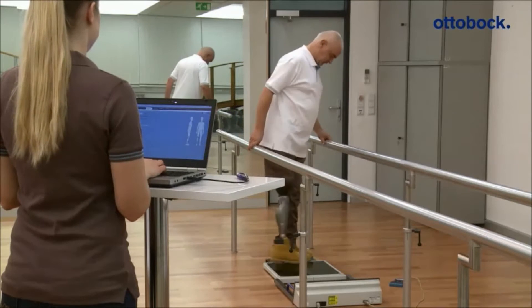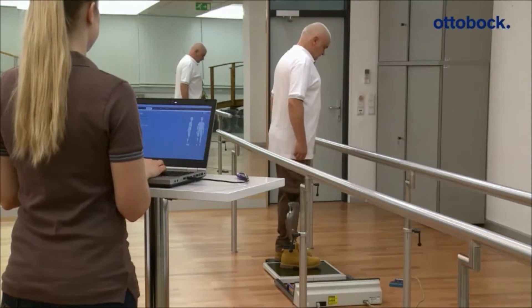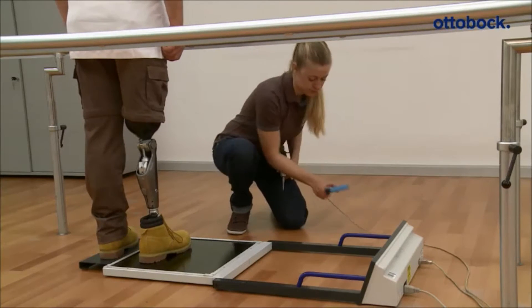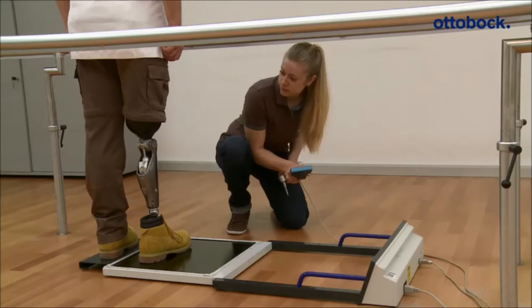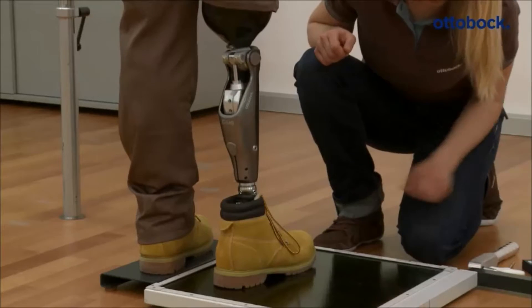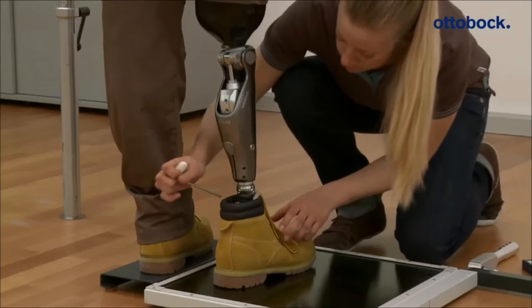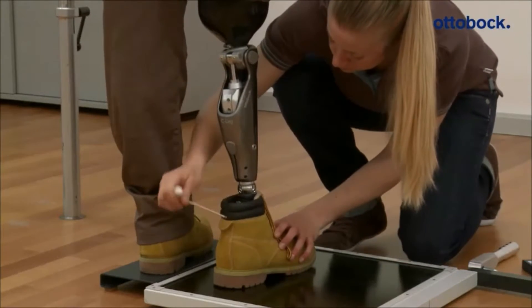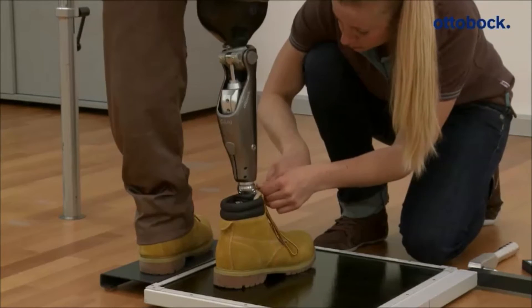Before the patient starts walking for the first time, the knee joint has to be calibrated in a standing position. This ensures that the knee joint works safely from the beginning. Both after the static as well as after the dynamic alignment optimization, a calibration has to be performed. An incorrect calibration can lead to swing phase initiation too early or too late.